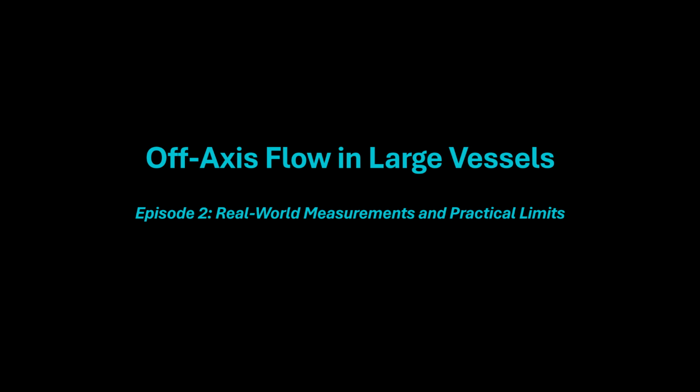In this episode, I want to show that flow quantification in large vessels like the aorta is far less sensitive to imaging plane orientation than many people assume, and why even fairly large obliquity by itself isn't a reason to discount flow values. I'll then explain some practical limits that become important as vessels get smaller.